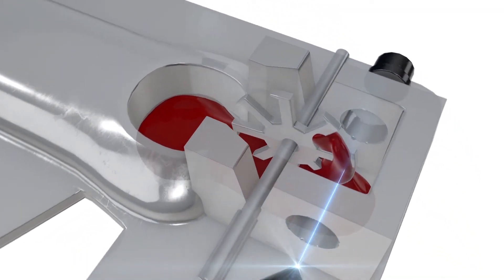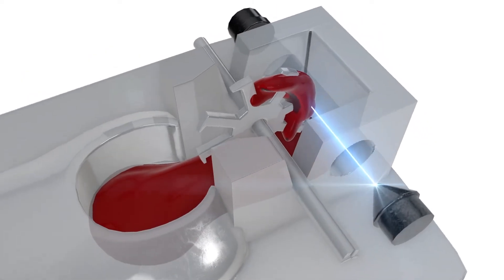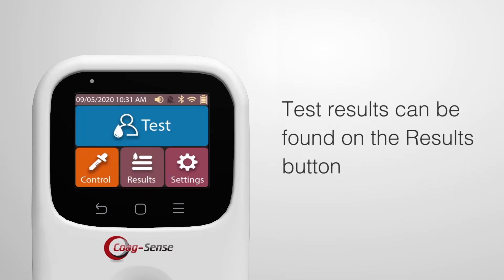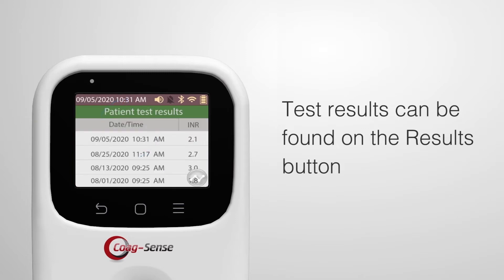Providing superior accuracy, this meter measures clot formation directly. No lookup tables, no algorithms. The actual time required to perform a test is the actual prothrombin time. Reliable test results are available in less than one minute.